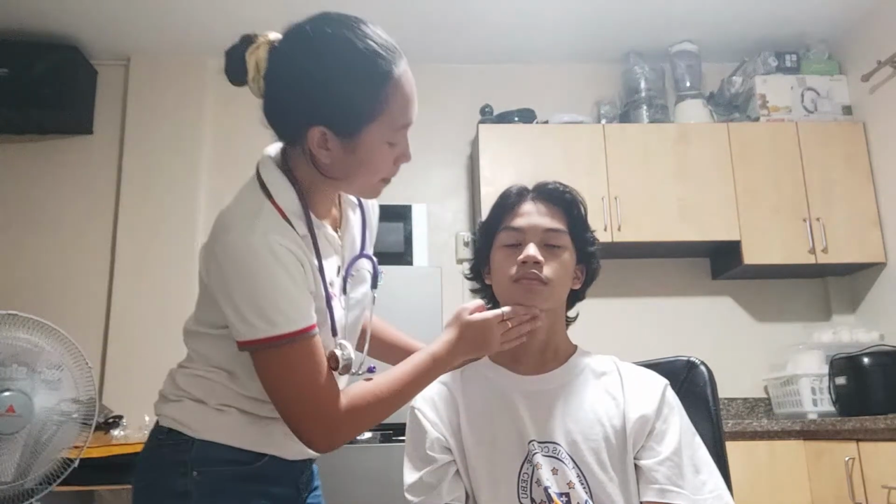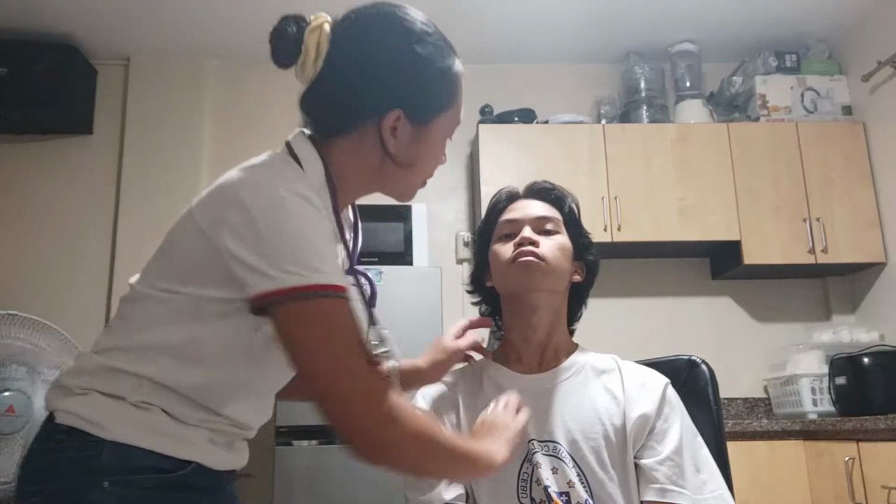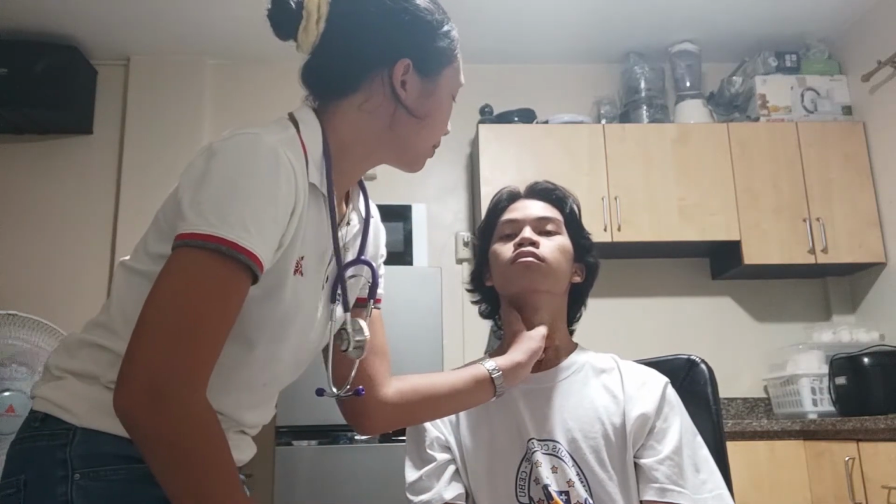And now, next is we're going to palpate the carotid artery. We will not palpate it bilaterally, it needs to be palpated individually. So let's palpate it side by side with the same strength, 2+, okay? Lastly, we're going to auscultate the carotid artery one side at a time. So we will listen with the bell and listen for any bruit sounds.